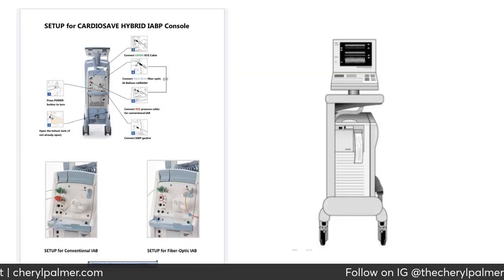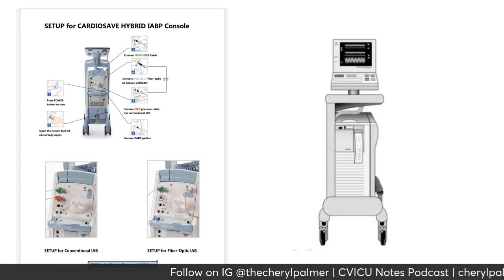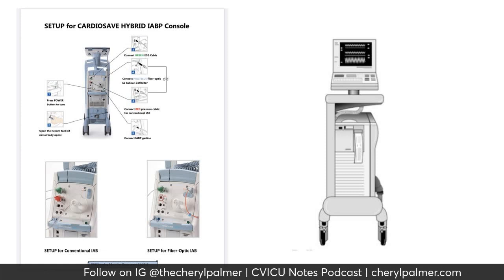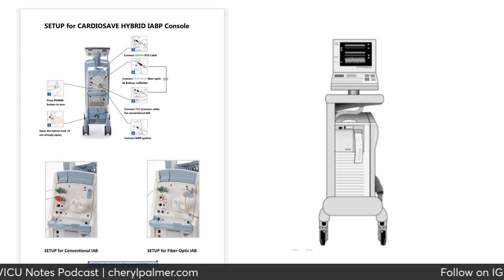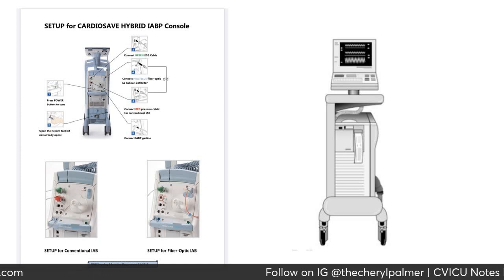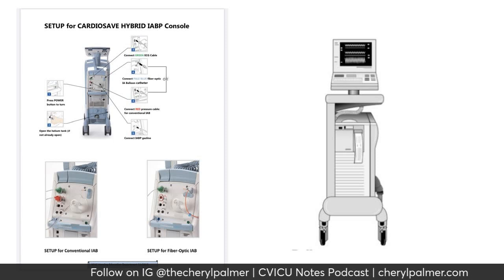Here is a setup for the CardioSave, a hybrid IABP console. Now, each hospital or center may have different ones, so you just have to refer to your hospital procedure for which one you utilize, but this is a general setup.